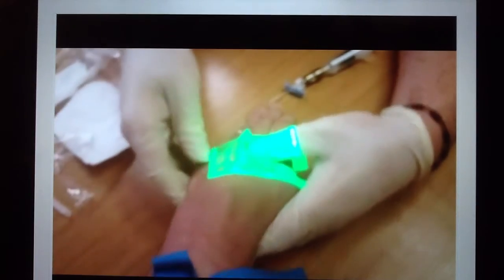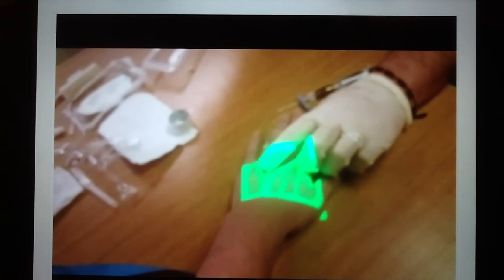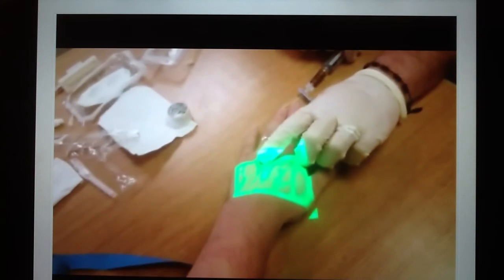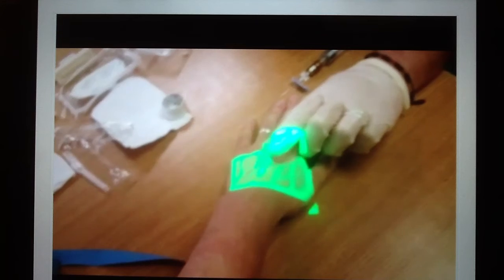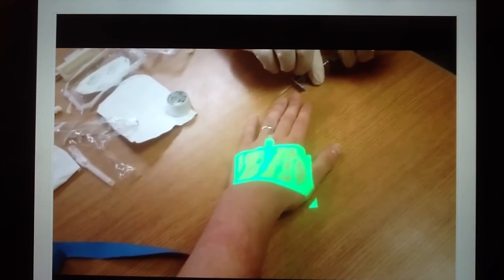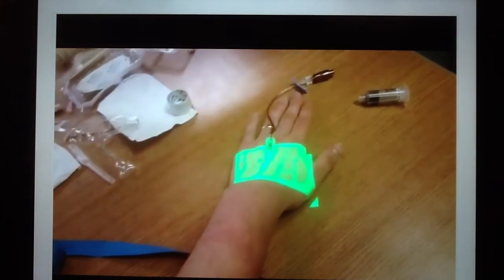Upon seeing flashback in the cannula, I further advanced it into the patient. Placing my thumb above the cannula ensures no blood flow will occur, and then I attached the secondary tubing. Once attached, you need to release the rubber band tourniquet, otherwise you will compromise the vein. I then flushed with 3 milliliters of normal saline, and good patency occurred. After removing the 3 milliliter normal saline syringe, I saw that blood flow occurred through the cannula, which further demonstrates good patency with the intravenous device.